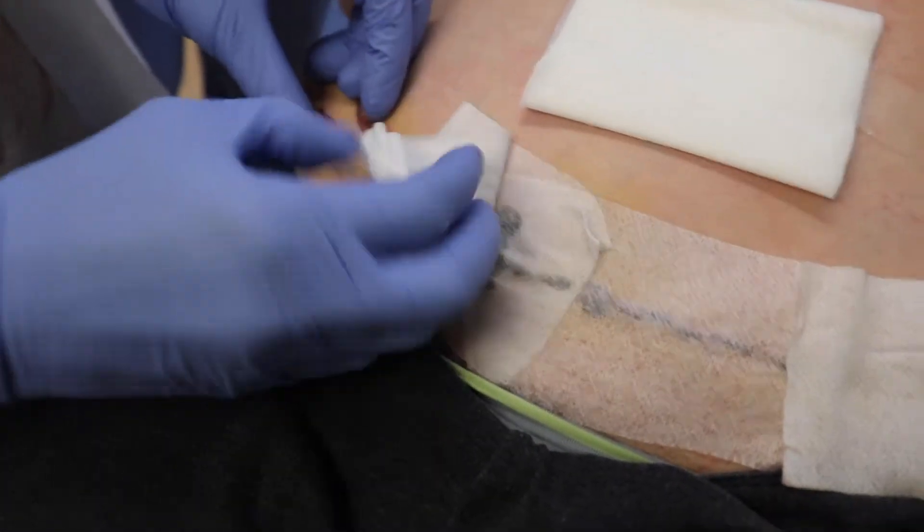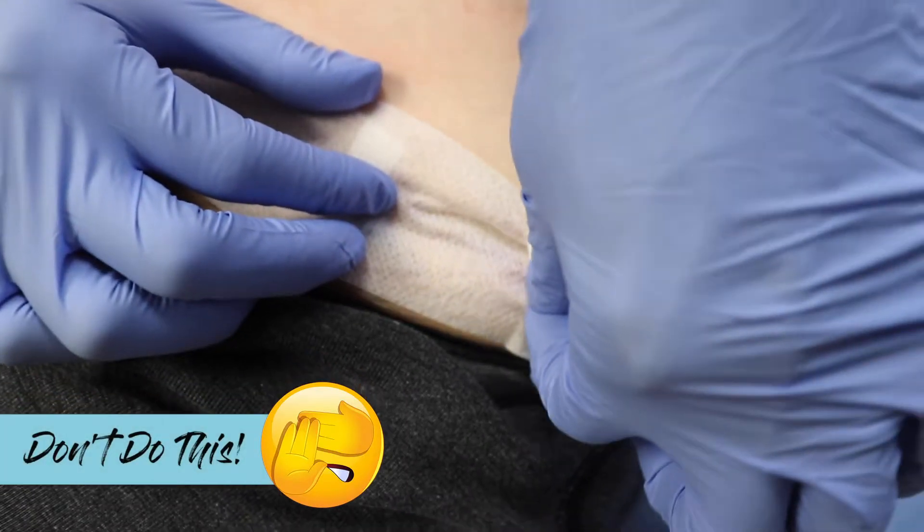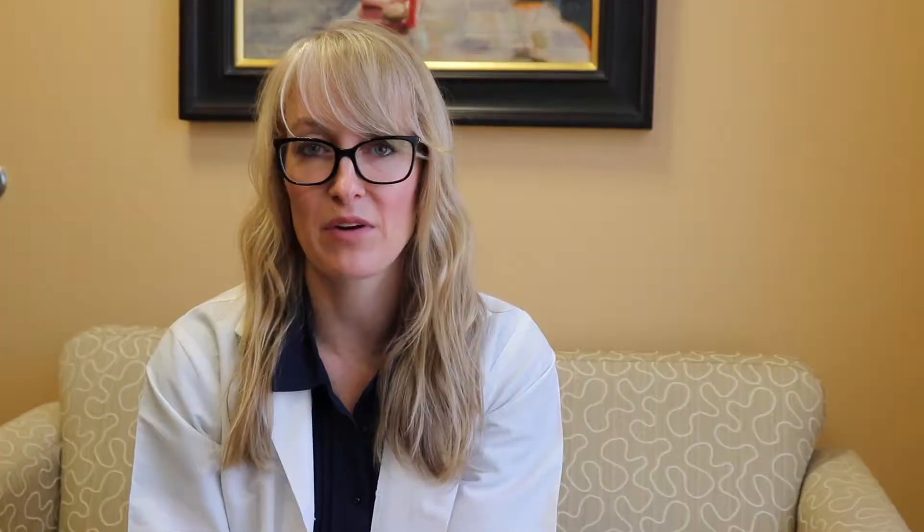The trick to changing your tape: when you remove the old tape, you want to pull it off in the direction of the incision. We don't want to pull the edges of the incision apart. The purpose of the tape is to really hold the edges together, support them, and prevent tension on the incision as it heals.